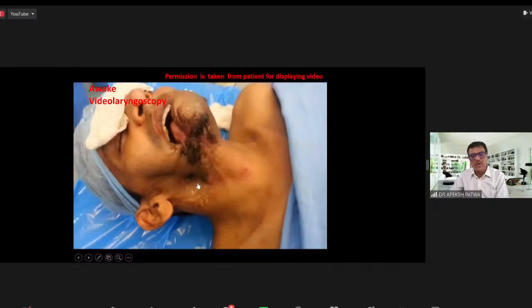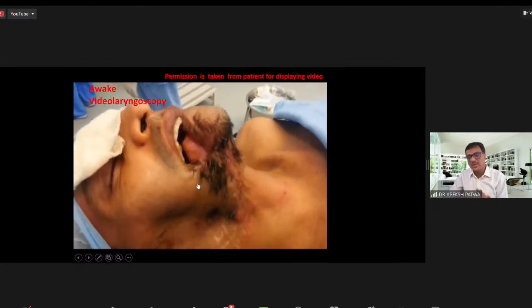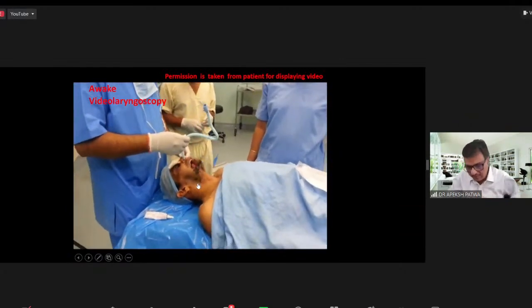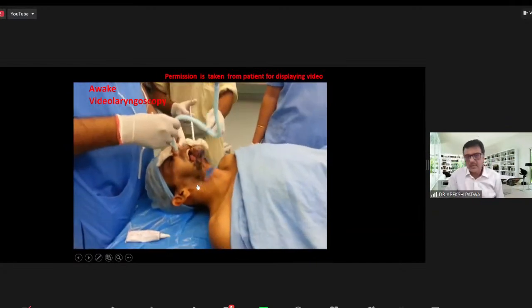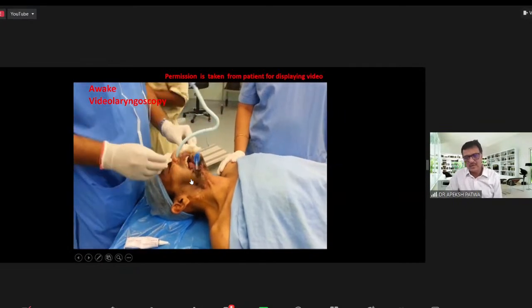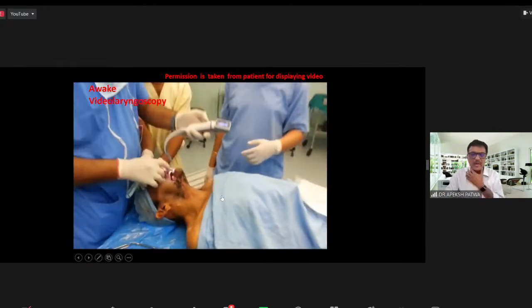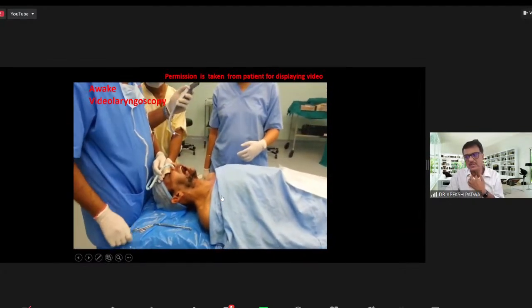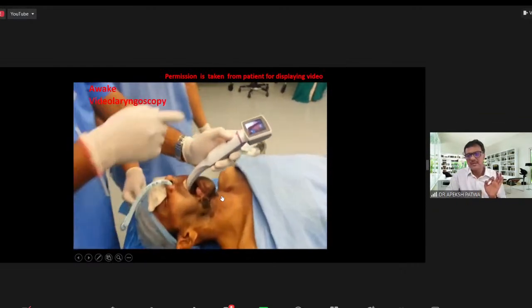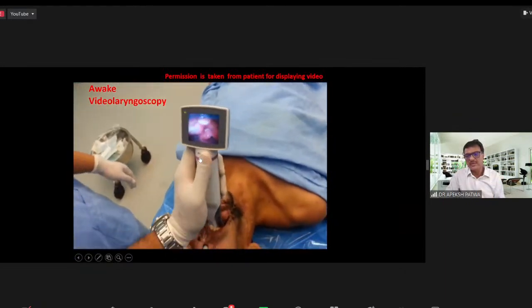This is one of the videos of performing an awake intubation in a post-mandibulectomy case for redo surgery. It's a nasotracheal intubation. We have used the non-channel video laryngoscope blade. Passing a tube into the nasopharynx and asking the patient to open the mouth. We have given the bilateral superior laryngeal nerve block and transcricoid spray. And look, I'm not giving any force. Able to see the vocal cord and epiglottis.